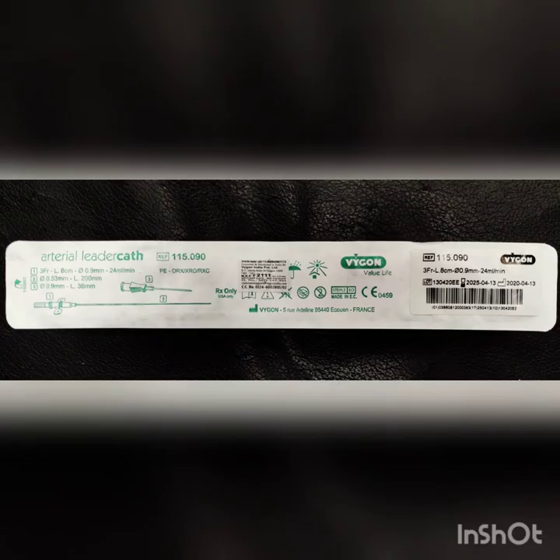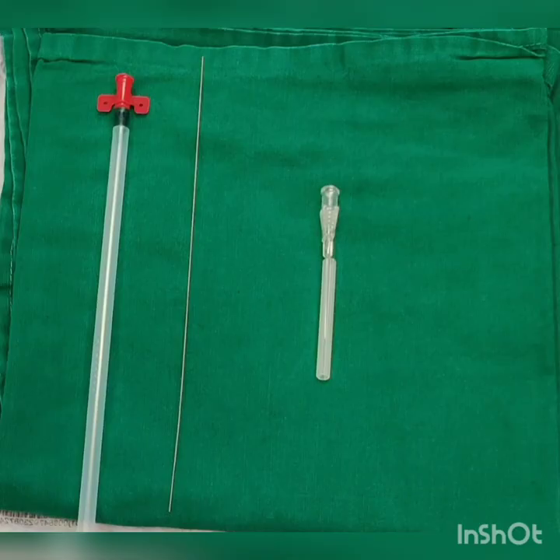Some people may use a 20-gauge gelco and others may use a pre-packed sterile arterial catheter kit, which consists of a stainless steel introducer needle with tapered hub, a guide wire with a flexible straight tip and a smooth surface, and a smooth flexible catheter with a special tip for easy insertion and fixation wings at the proximal end.